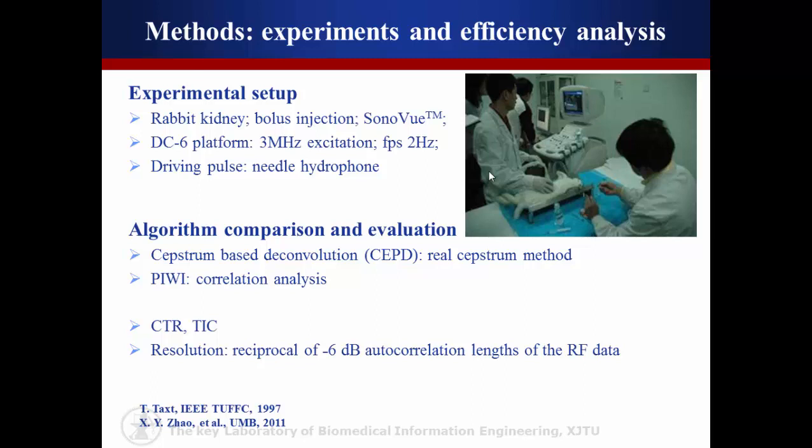And PIWI combined PI with wavelet transform to enhance CTR by analyzing the correlation between the bubble wavelet and the received echoes. All the details can be seen in these two references. And the methods were evaluated from CTR, TIC, and the resolution.